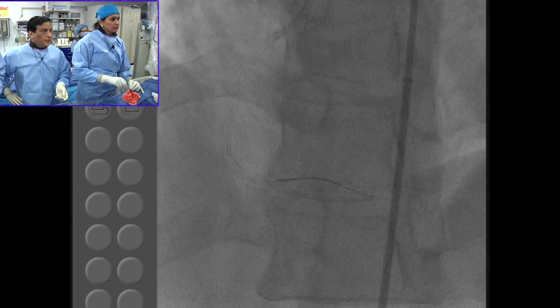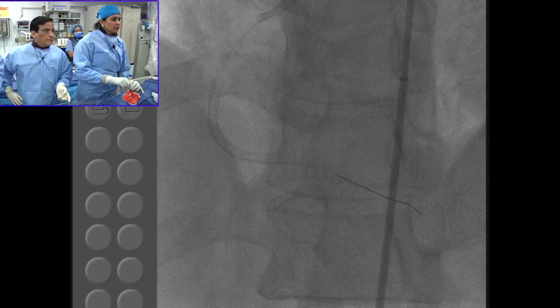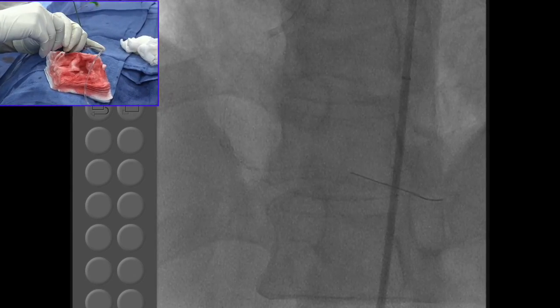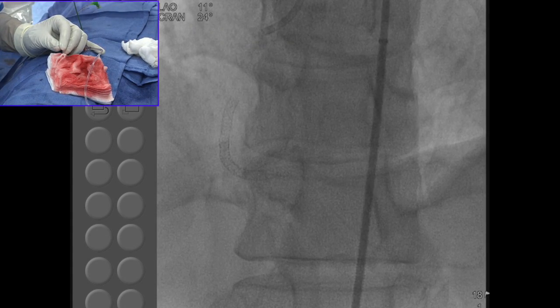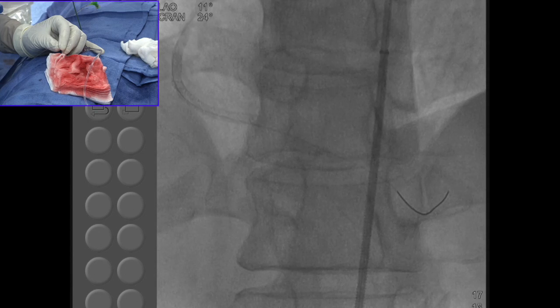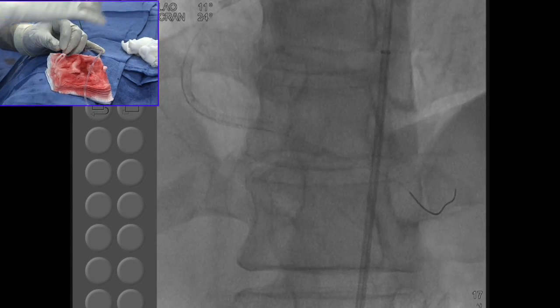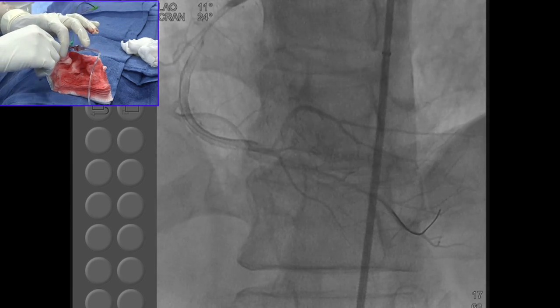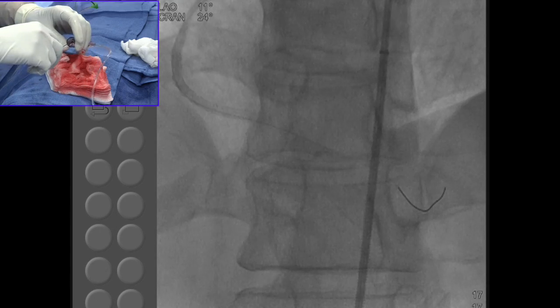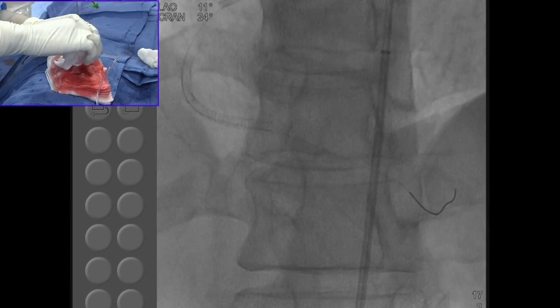I think we should take 275 or 2.5? 2.5, 12 or 16. Let's decide in 1 second. I think 12 will be okay. Across, yeah, 12. Okay, 2.5, 12. So that may help in matching that disparity also, and if required, we do a post dilatation there.